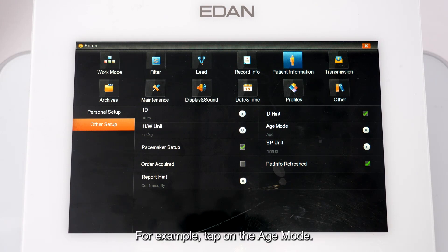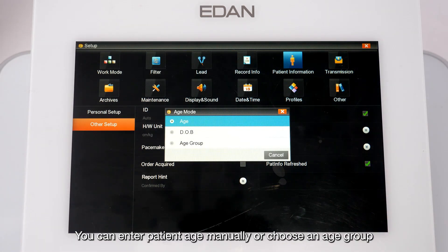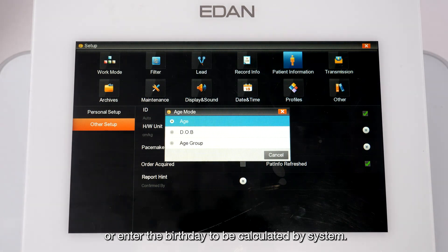Tap Customize 1 or 2 to enter a title to display in the patient information dialog box. In the Other Setup screen, you can find additional patient information settings — for example, tap Age Mode to enter patient age manually, choose an age group, or enter a birthday to be calculated by the system.